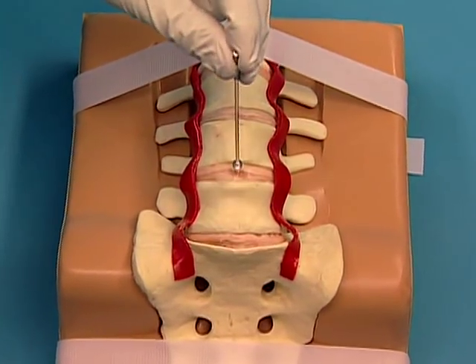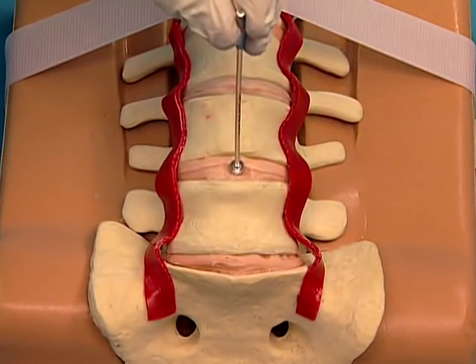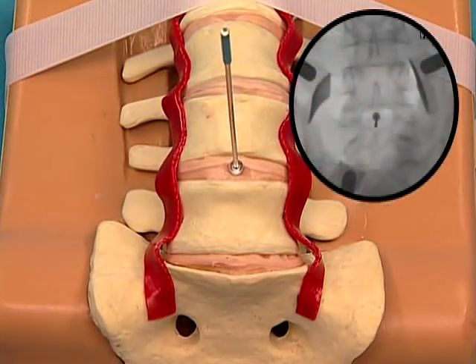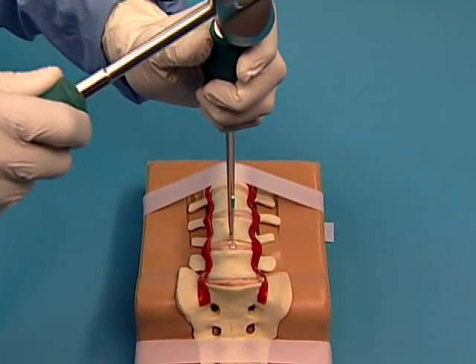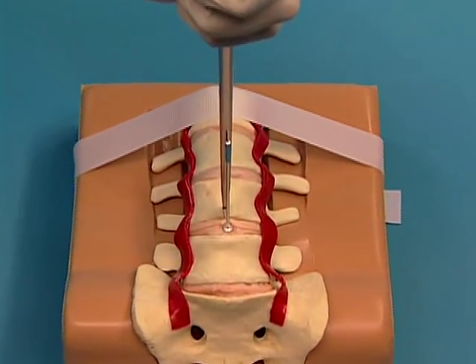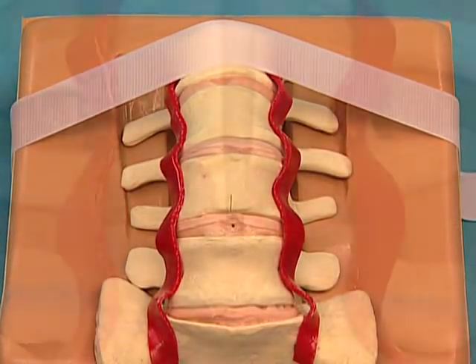First, identify and mark the midline. Center the midline indicator in the disk space. Use AP fluoroscopy to confirm the midline of the operative level. Once the midline is confirmed, mark the midline on the superior and inferior vertebral bodies so the mark remains visible throughout the procedure.